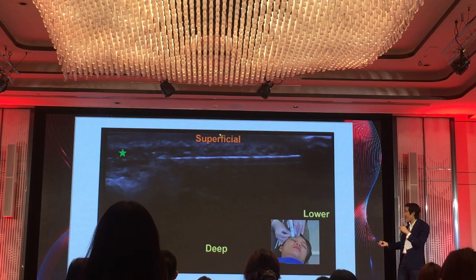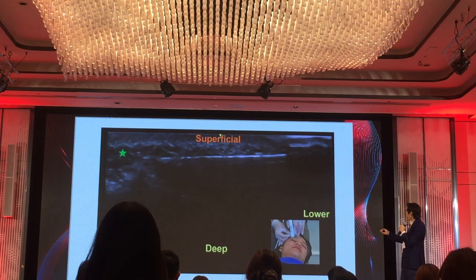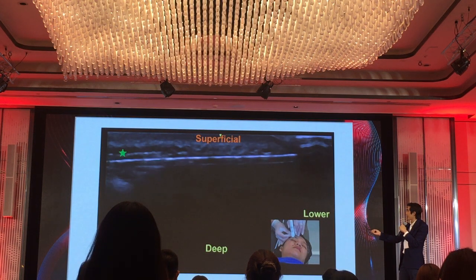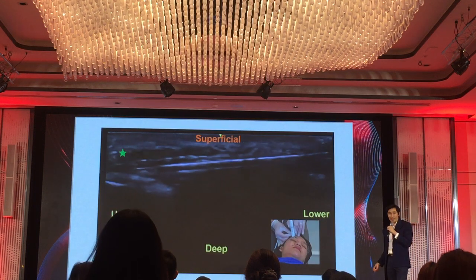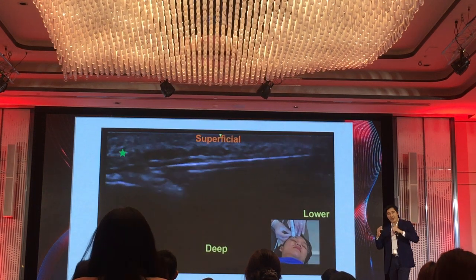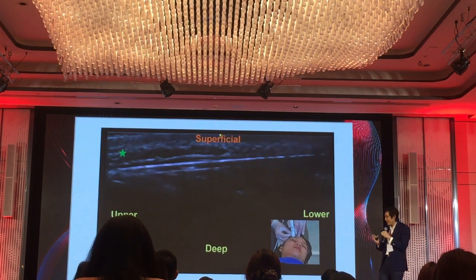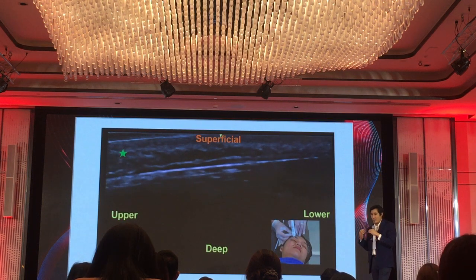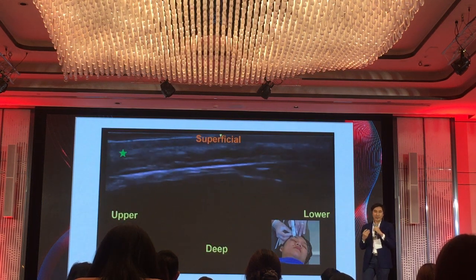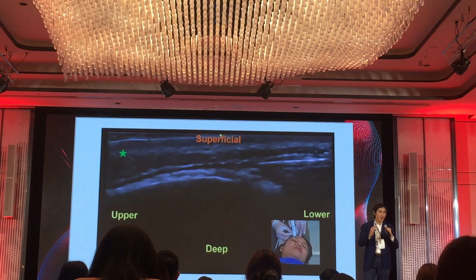Then I reinsert and see that now my cannula, the bright white line, is underneath the fascia, which is the green star labeled here. So I'm now in the correct plane, and the feeling of the cannula is obviously tighter, with better lifting and better anchoring. Yes.